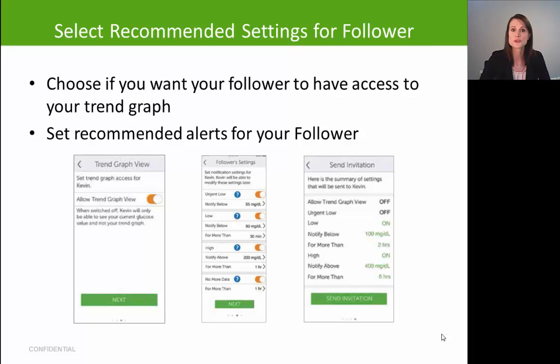The share setup will ask if you want to grant your follower access to your trend graph — meaning can they view up to the last 24 hours of glucose information. You'll then indicate recommended alert thresholds for your follower for high and low glucose. One alert setting to note is the 'No More Data' option: if toggled on, your follower will receive an alert if they're no longer receiving your glucose information, which can be a useful safety feature. Once you've set those recommended alert levels, go ahead and send the invitation.